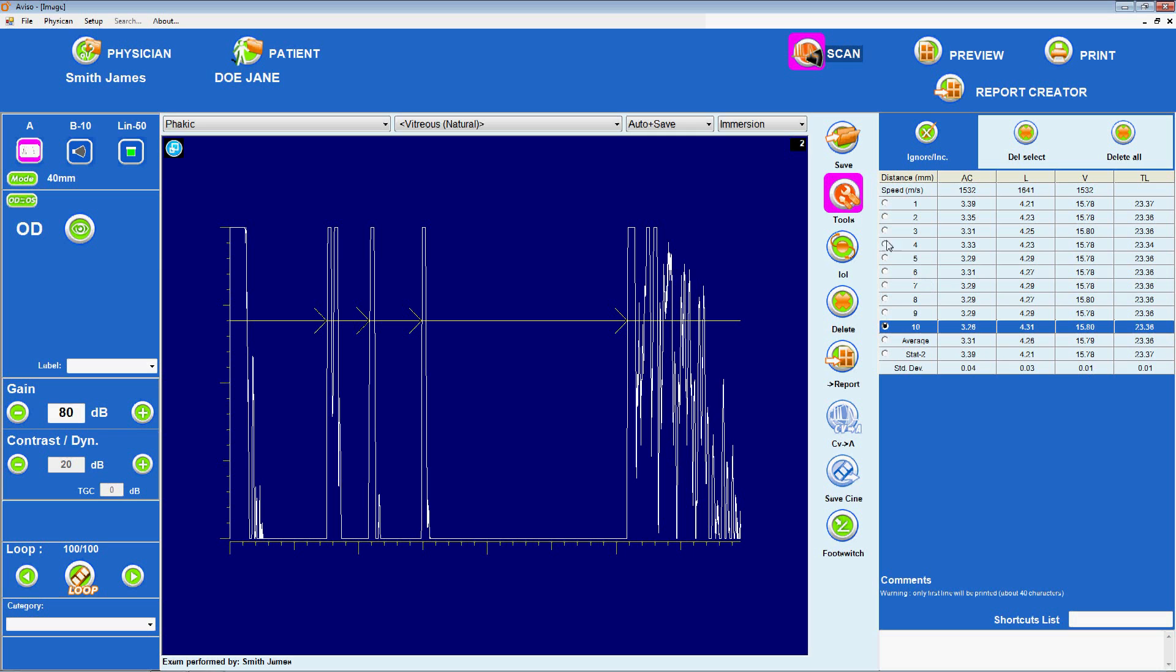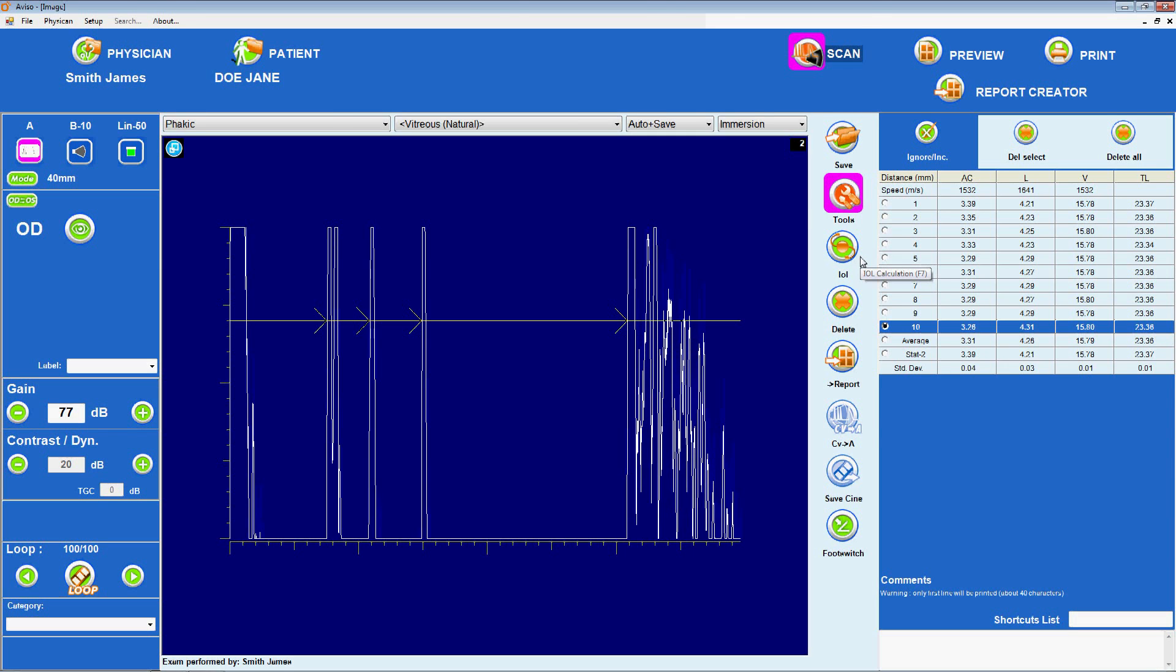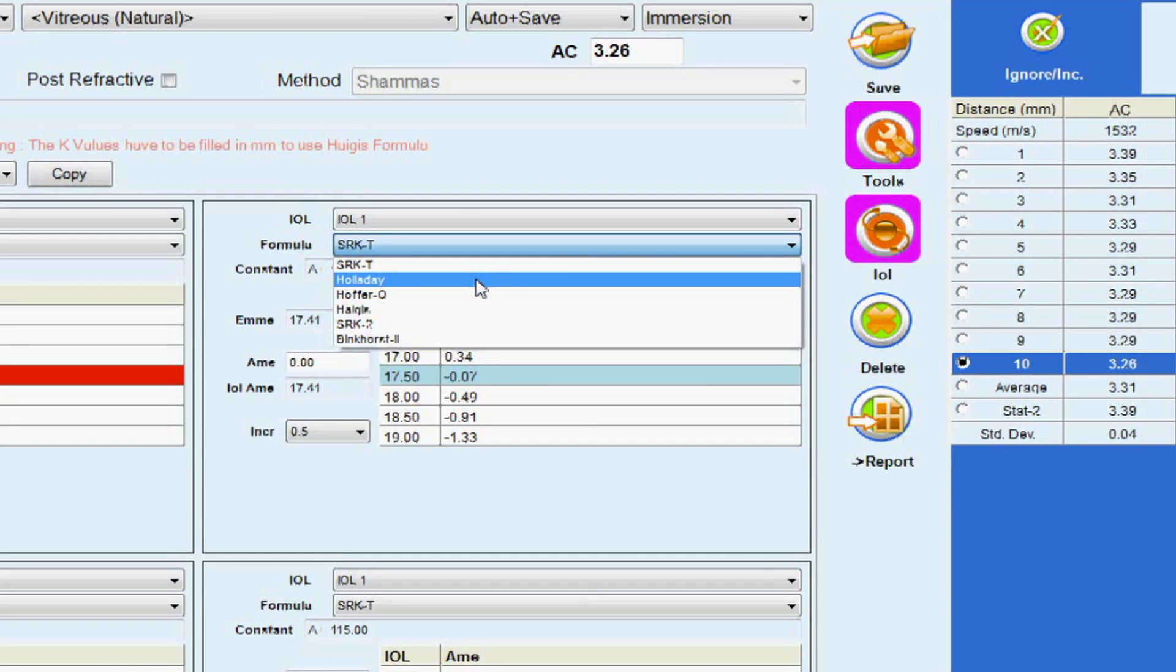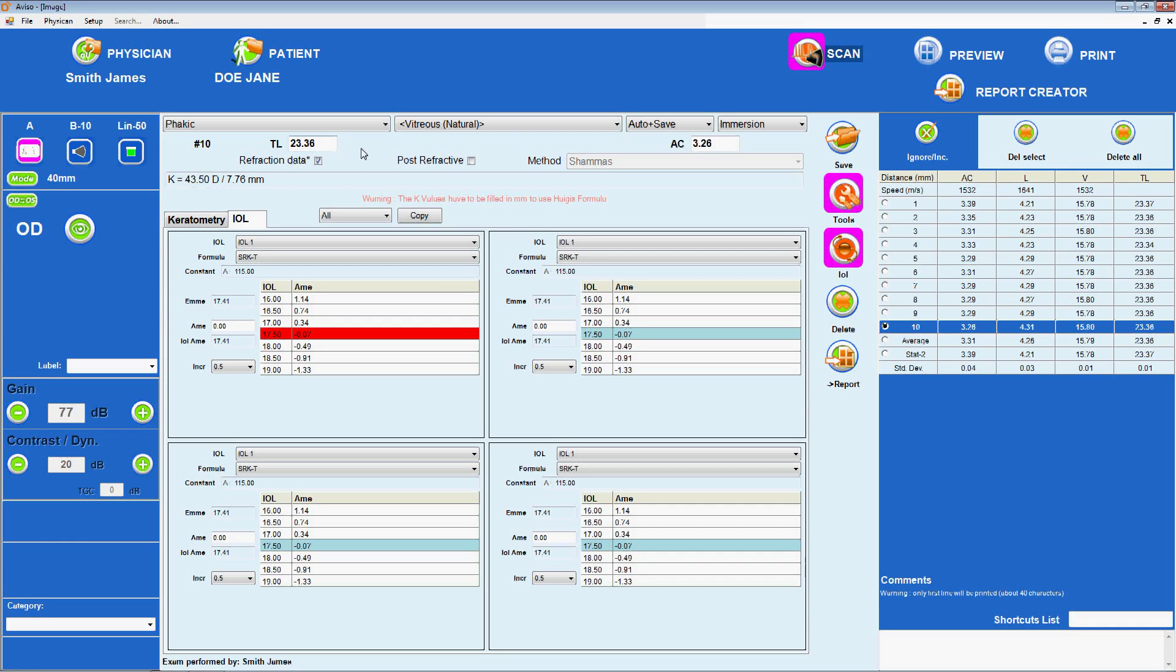The Aviso is equipped with six IOL calculation formulas, including the SRK2, SRKT, BinkHorse 2, Holiday, HofferQ, and Hagus. Once patient data has been entered and scans have been obtained, the IOL calculation can be performed.